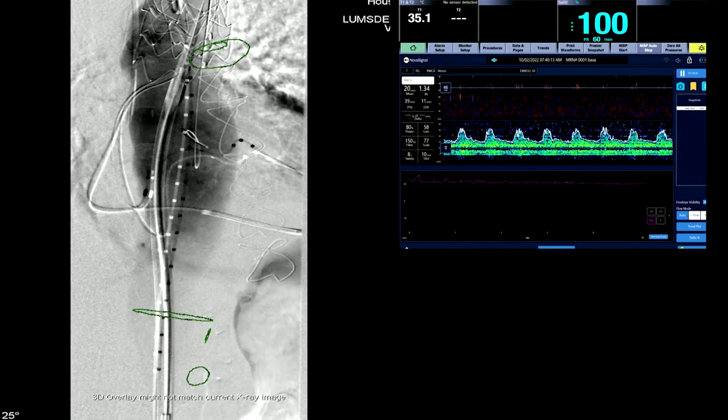Looking at the TCD now, there's no evidence of embolization at all. We're looking for the origin of the celiac, and we're going to deploy right at the top end of the celiac — you can just see it flashing in the background there.